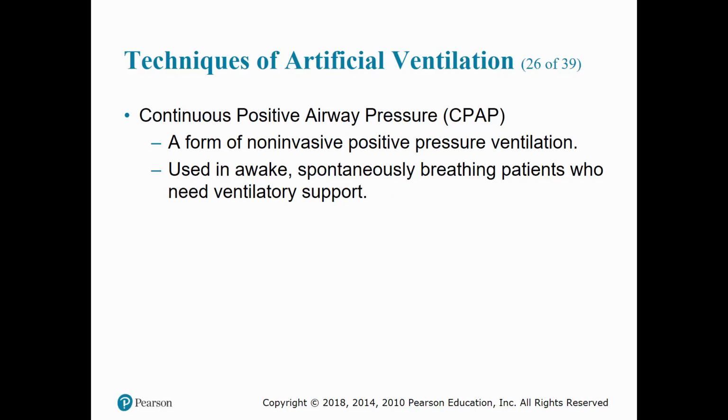CPAP, or continuous positive airway pressure, is a form of non-invasive positive pressure ventilation. We use this in patients who are awake and are breathing on their own who need ventilatory support, such as a patient who has congestive heart failure and has fluid within the lungs, or an asthma patient who has severe bronchoconstriction and it forces air into the lungs, forces those bronchioles open, and if there's fluid, it forces that fluid out of the lungs.